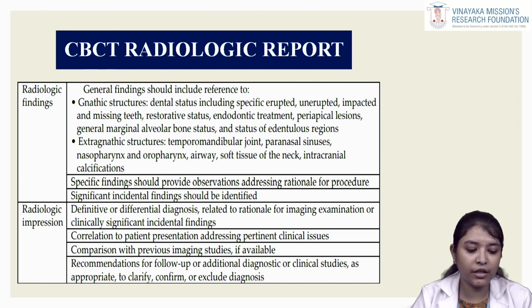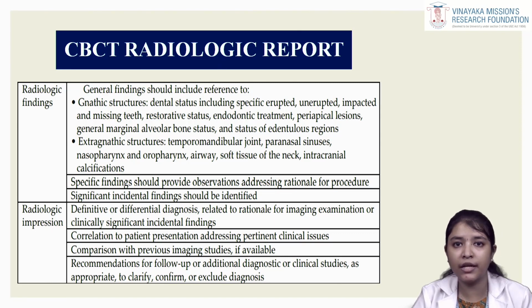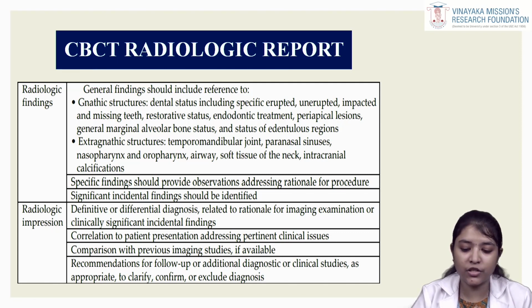And the radiologic impression, that is the final diagnosis, can be given. If you want to give any differential diagnosis, you can also provide the differential diagnosis in the report. And in case of any previously treated case that is for reassessment, you can also mention the difference in the impression itself.